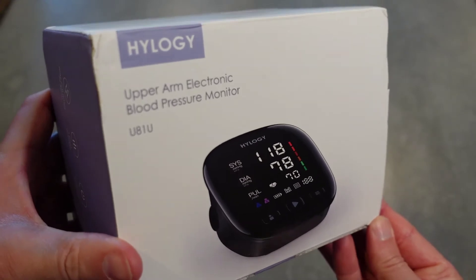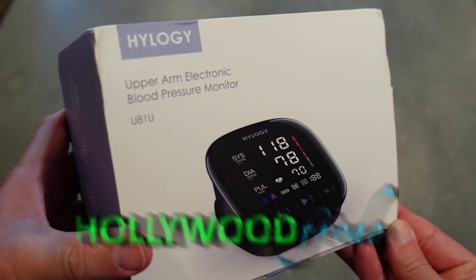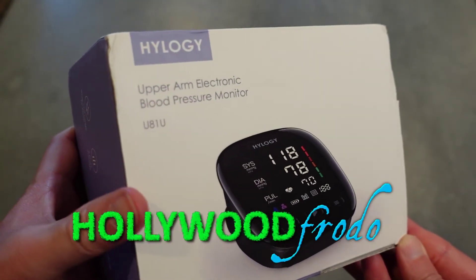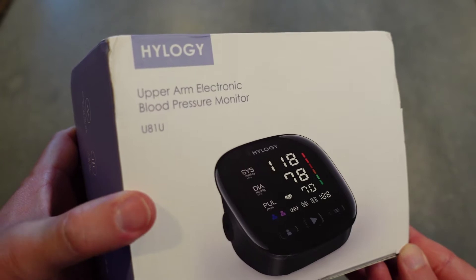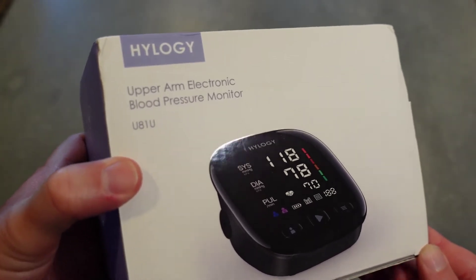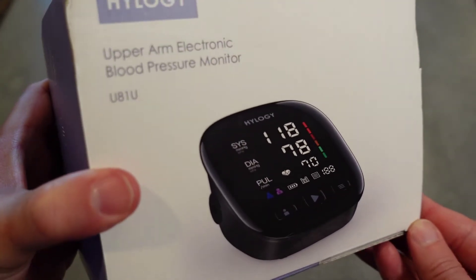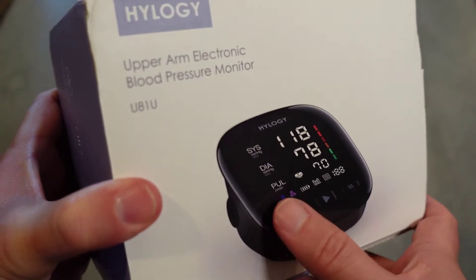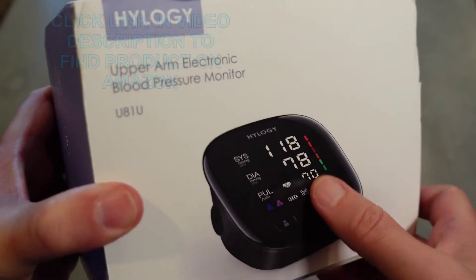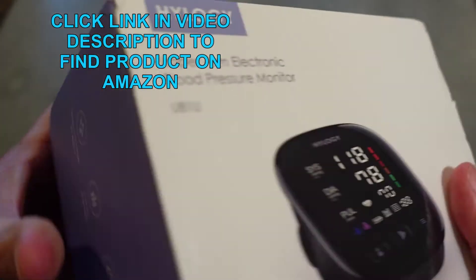Welcome to another edition of Eric's Product Reviews. I am Eric and this is just going to be a quick unboxing of the Hylogy Upper Arm Electric Blood Pressure Monitor featuring memory for two different people and a color display.